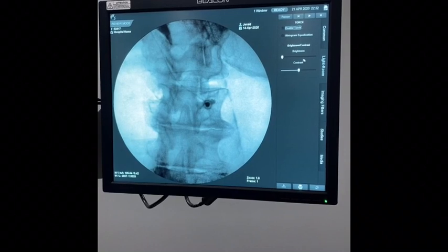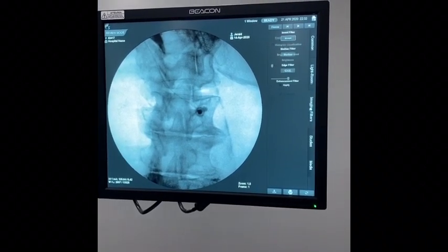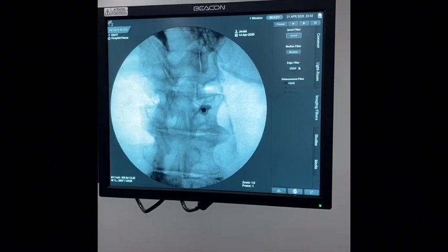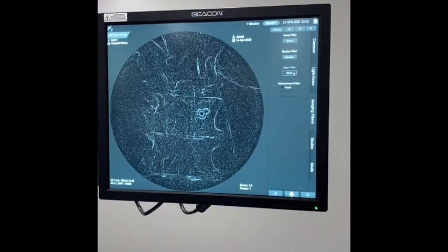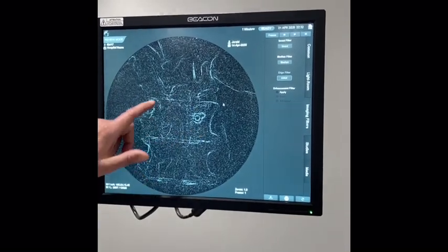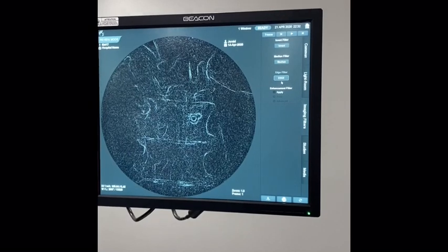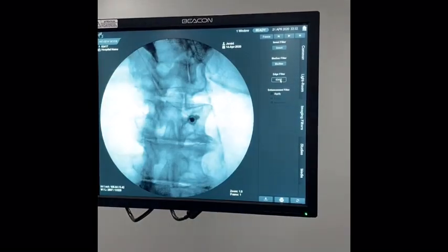There's brightness control and contrast adjustment, along with imaging filters. This is the edge filter — it's not a perfect picture to show it here, but you can see how it outlines the bone. If you had metal protruding, it would show you exactly where it is. Something like a hand would show much better.